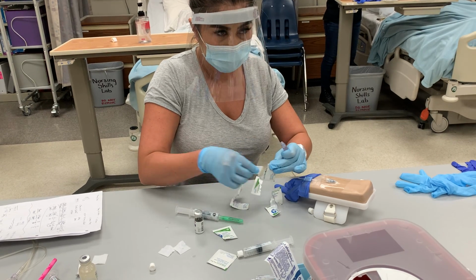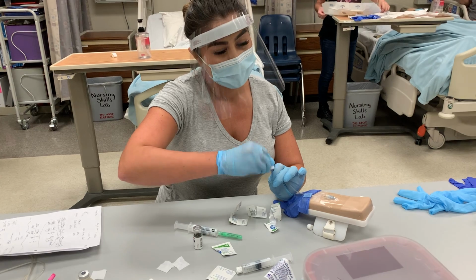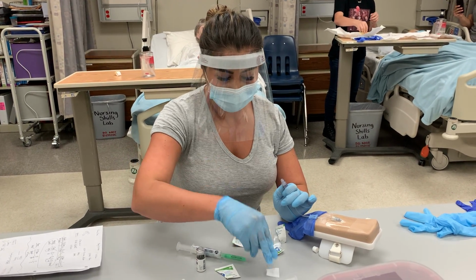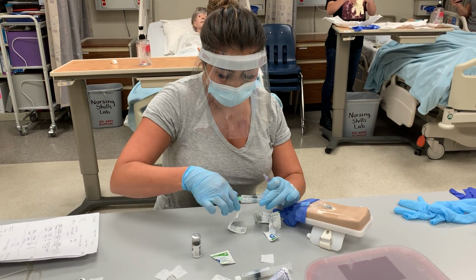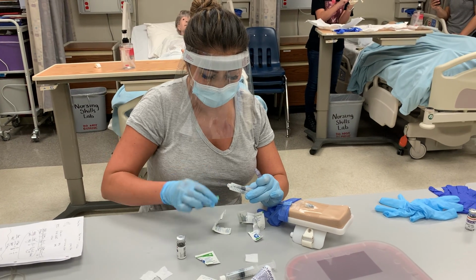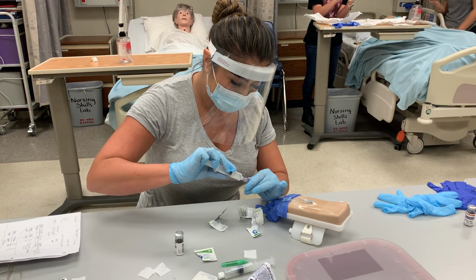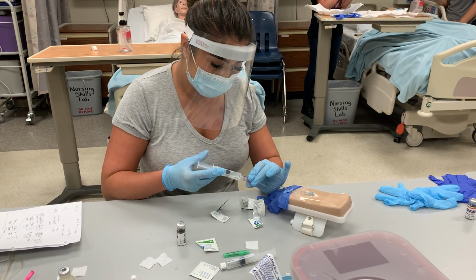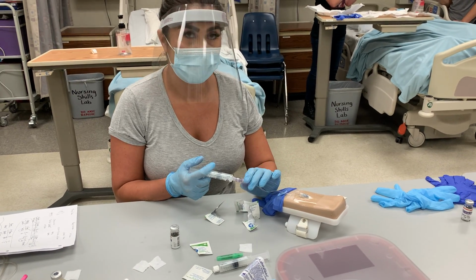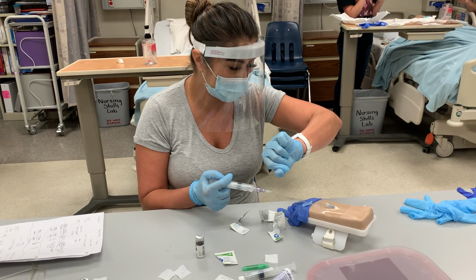So I'm going to scrub the hub for 15 seconds. Okay. I need to remove this. Now I'm going to be pushing 0.75 mL every 30 seconds, and we're giving this over 4 minutes. So I'm going to go ahead and start.